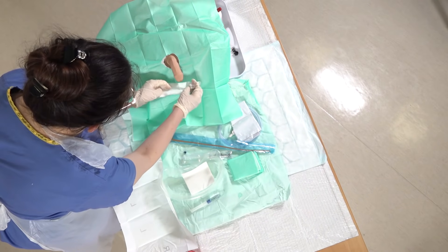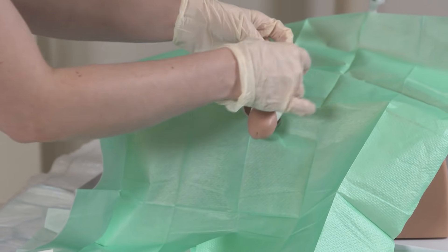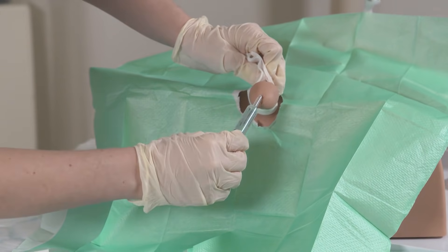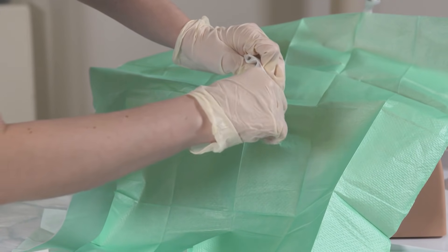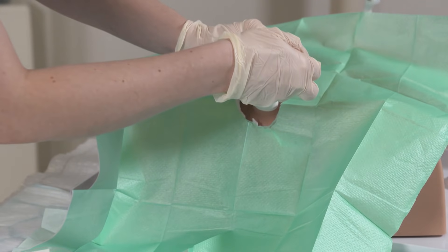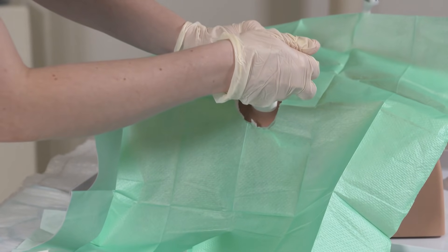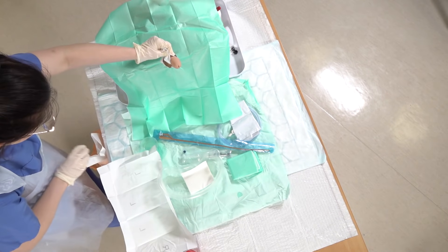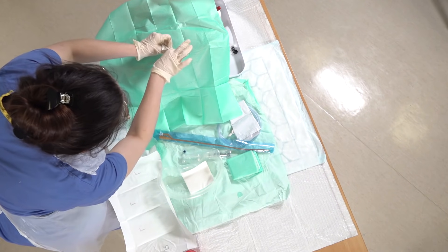Using our sling, put that around the penis to hold it up. I'm going to insert the instiller gel into the urethra, and then we can discard that syringe.